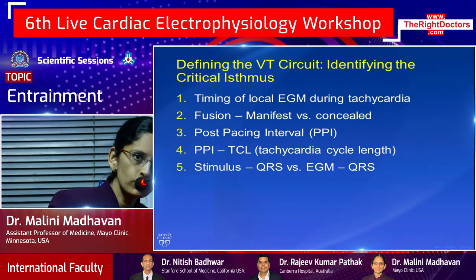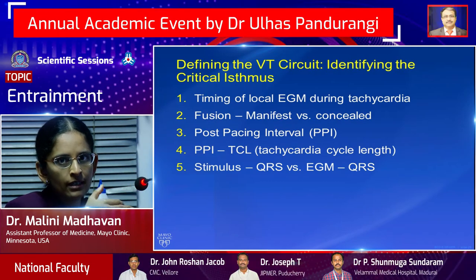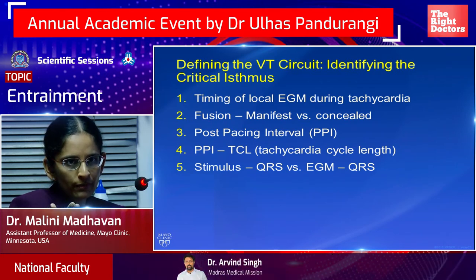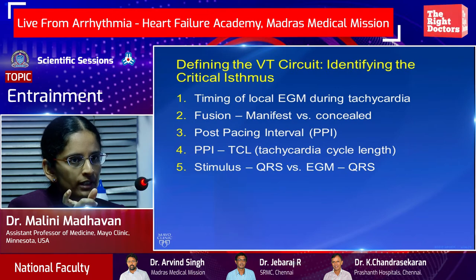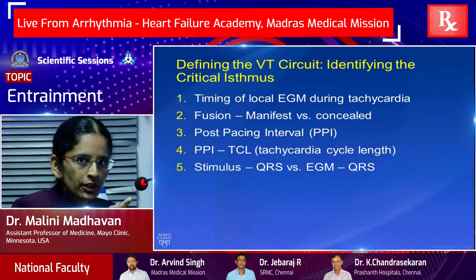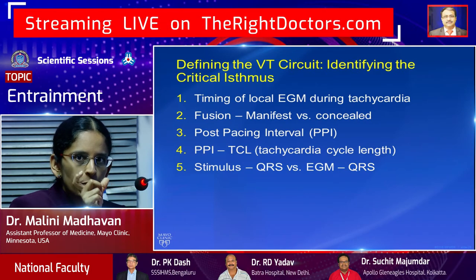So what is the post-pacing interval? It's basically the time from this last stimulus to the return electrogram on your pacing electrode. And what that represents is the time it takes for the activation to go from your electrode to the circuit, through the circuit, and back to your electrode. So that's the post-pacing interval.